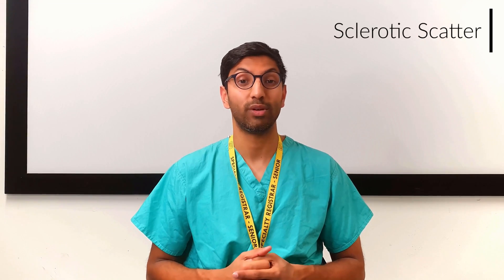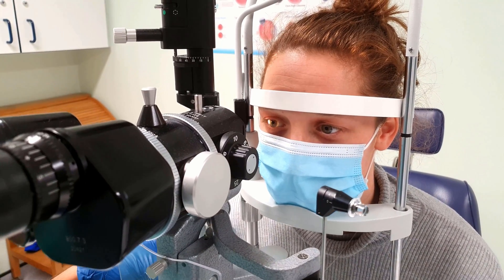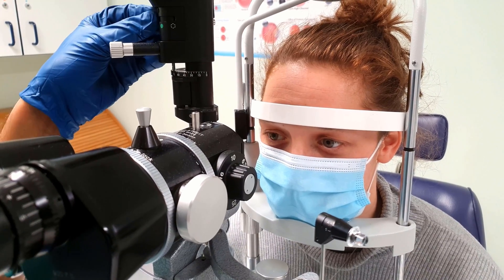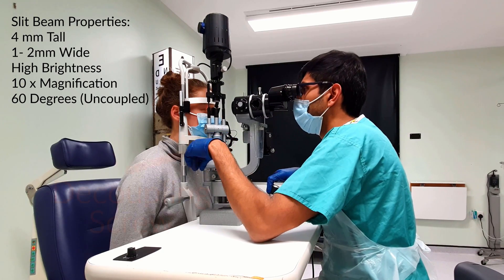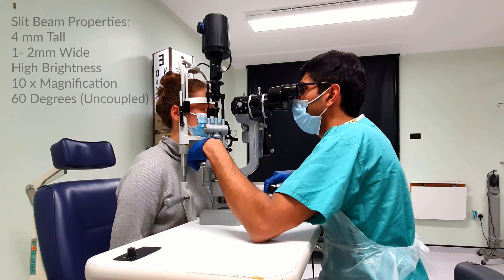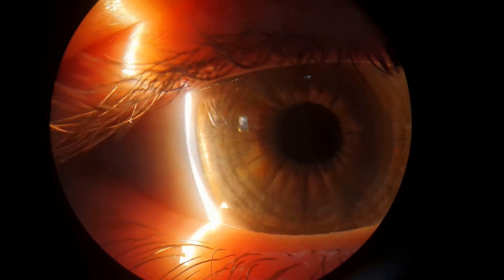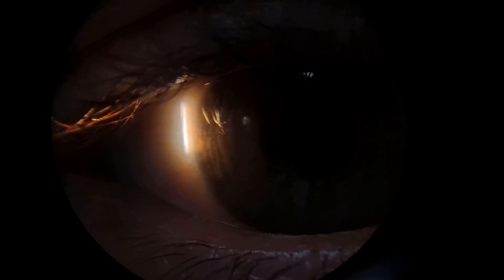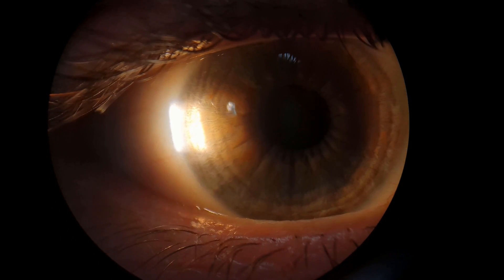Sclerotic scatter. This involves decentering the slit beam laterally so that the cornea acts as a light conducting medium. With total internal reflection, you get a generalised glow around the limbus. This can be used to highlight subtle corneal stromal opacities such as corneal oedema or deposits. Focus on the cornea with the illumination angled at about 60 degrees, then uncouple the light source so that it's positioned on the limbus. Increase the light intensity and adjust the height so you get a complete halo around the limbus, ensuring the microscope remains focused on the cornea.